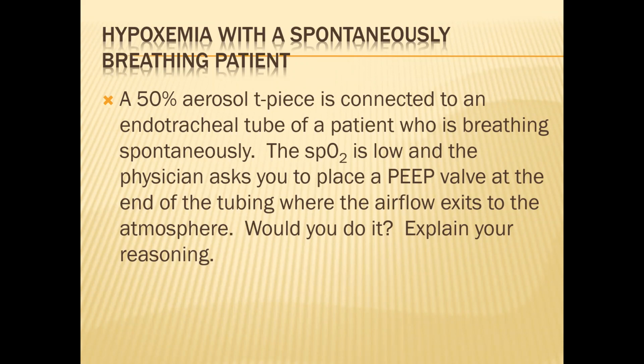Oh, really? Why would we do this? LMA is usually used when you can't get an endotracheal tube in.